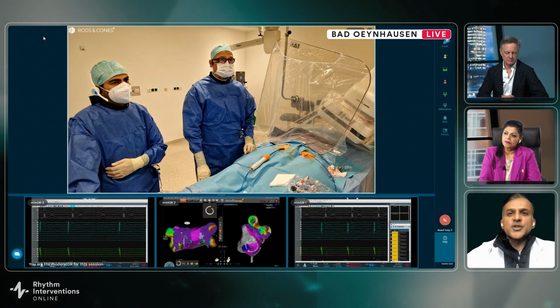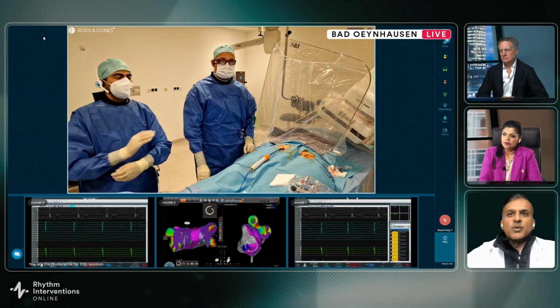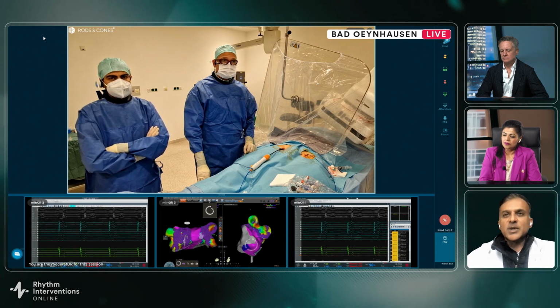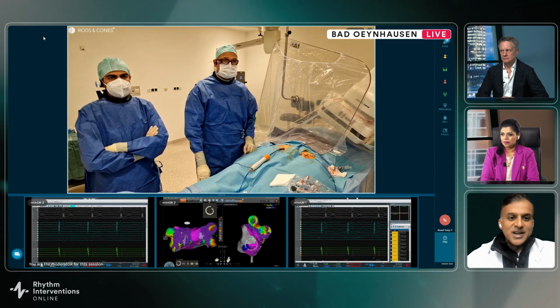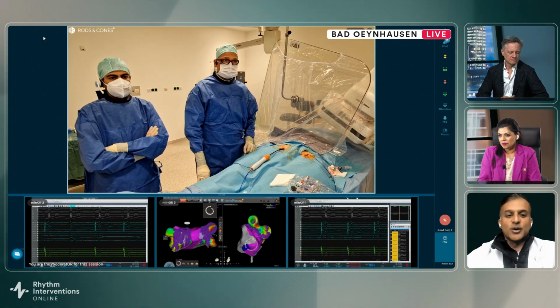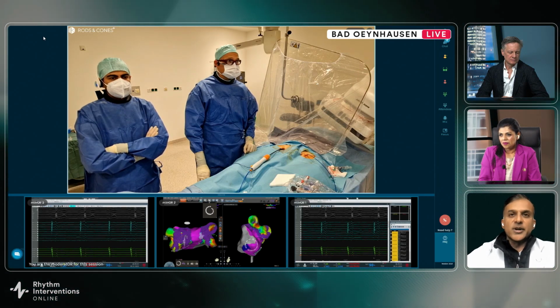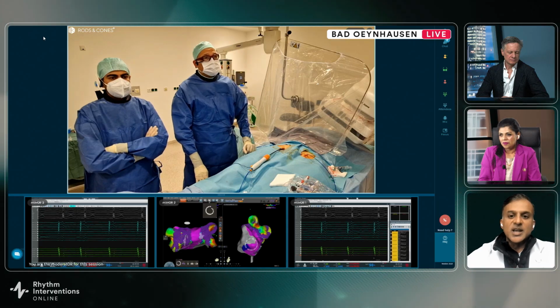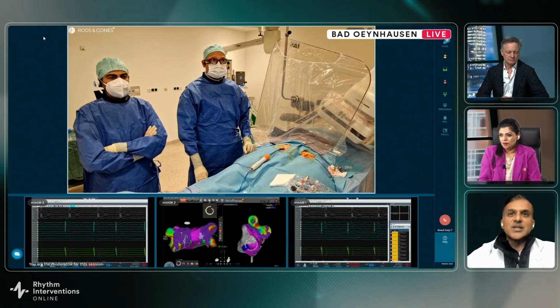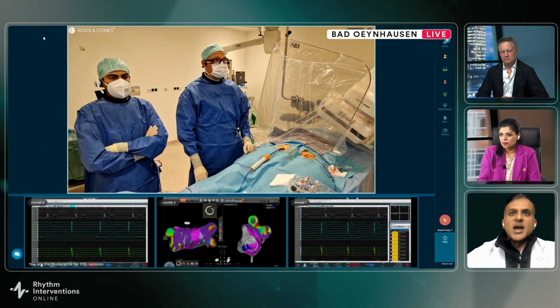When we first started using this catheter and did a lot of high density mapping pre and post, we found there were certain locations, just like when we did cryo remaps, where we kind of know the reconnections tended to be with cryo. They occurred in very similar locations. So now we will often target, on the left side, the posterior carina with an extra lesion. The upper part of the left upper is another area, either with ICE or with an extra lesion, to make sure that we have good coverage there.